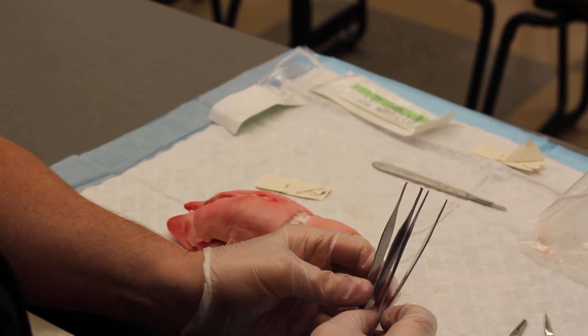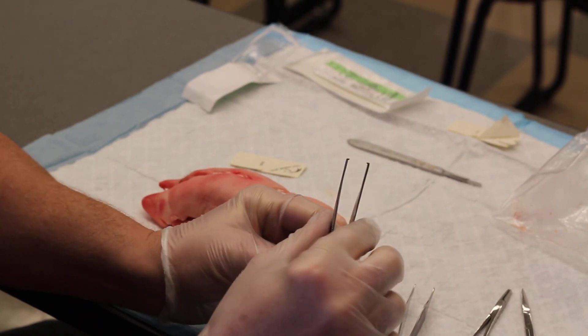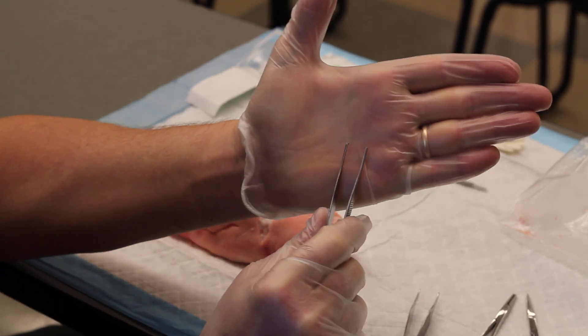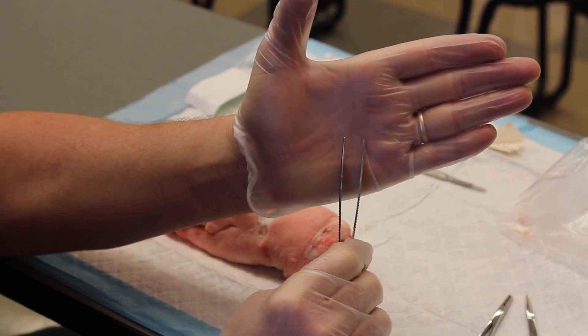Reminders: you've got two types of Adson forceps. One of them has teeth — you can see the little teeth there — and then the other one is without teeth.